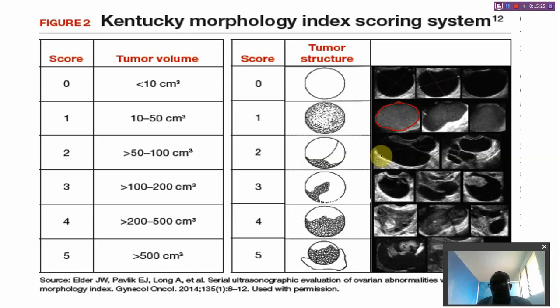And the second finding is about 100 cubic centimeters. So this is multiple cystic lesions in the ovary with septations. This is not polycystic, but these are hyperstimulations of the hormone that are affecting the ovaries. So you can see multiple cystic lesions in the ovaries. They have septation, fine septation. Some are multiple, some are even two in the ovary.